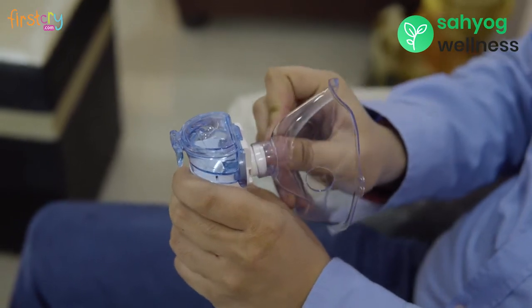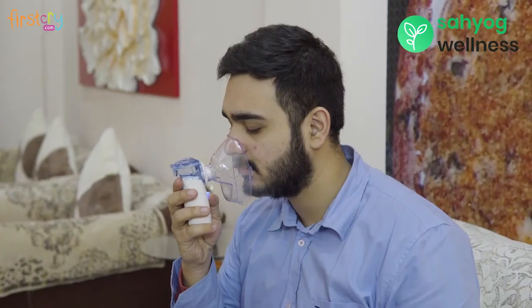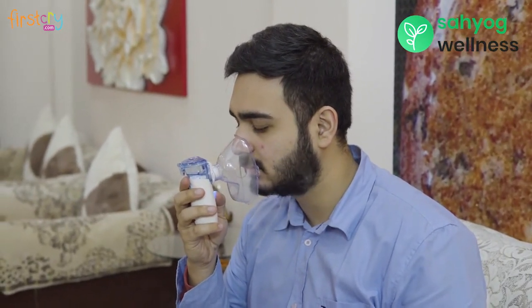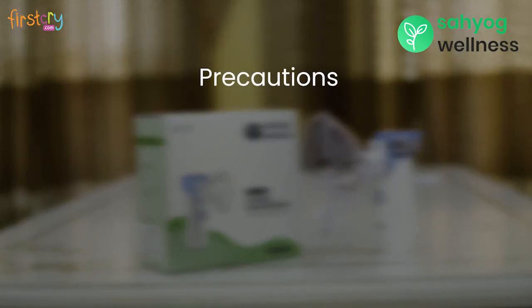Connect the mask or mouthpiece and push the start/stop button to start the nebulizer. Begin treatment according to your physician's instructions. Inhale and exhale naturally.